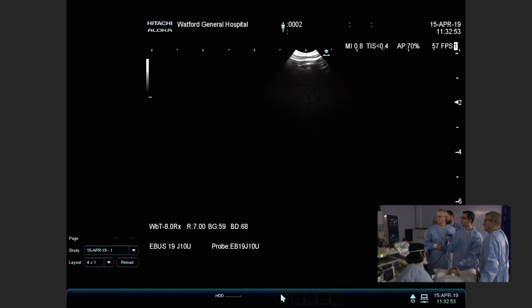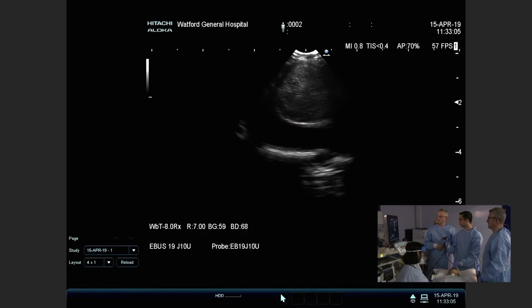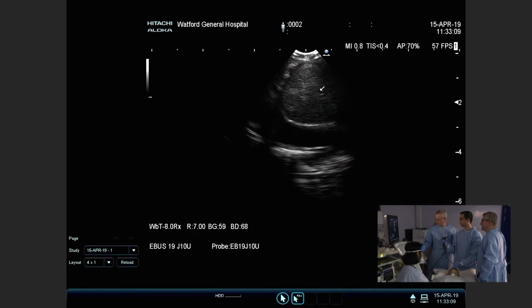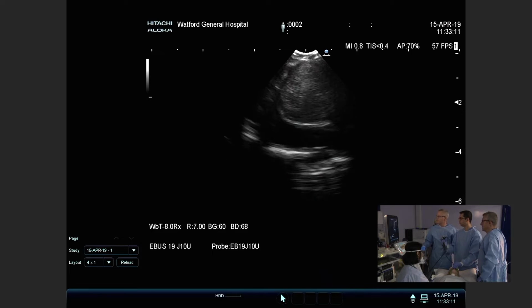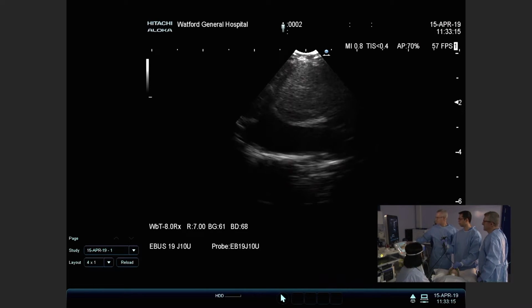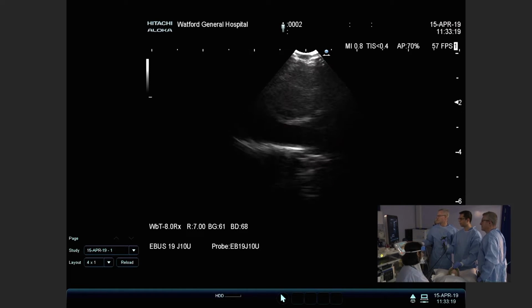Again, you sit above the carina, 1 to 2 cartilage interspace above, and around 1 to 2 o'clock position. So you turn your hand clockwise about 70 to 80 degrees, and there is 4R. Again, can we just have the gain up a little bit? And the SVC is a little bit compressed.